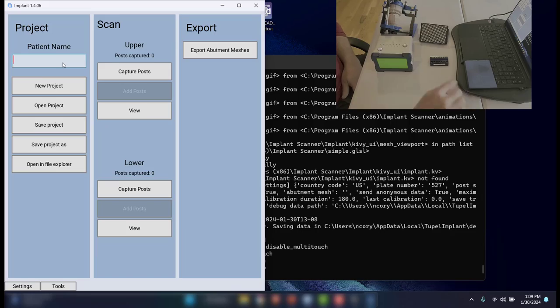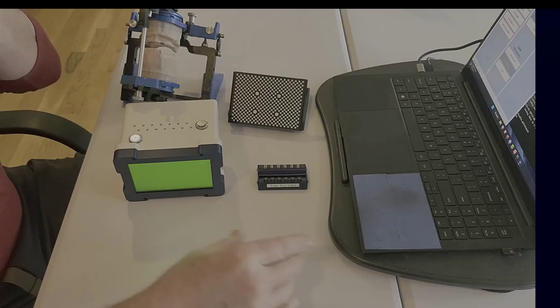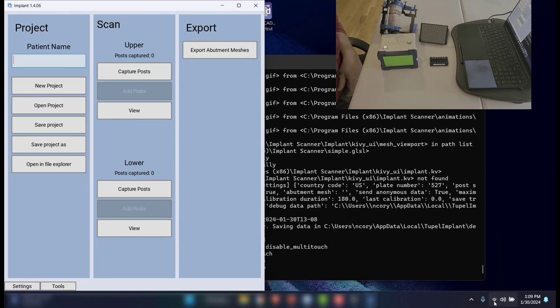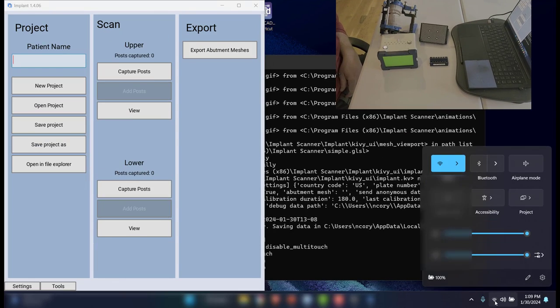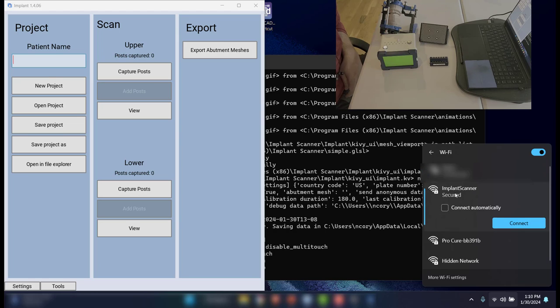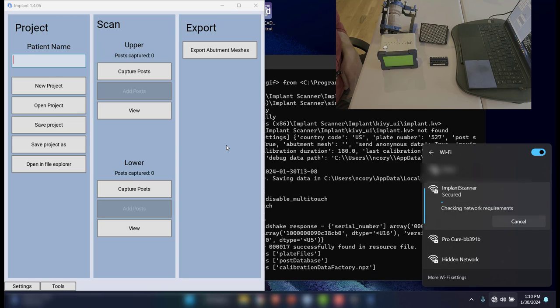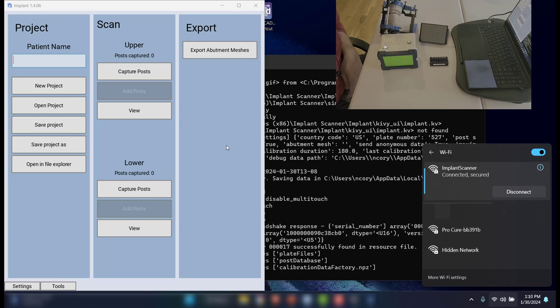All right. Notice that the scanner screen has turned green in the viewfinder now. That's indicating that it's ready. And so once it is ready, I do need to connect to my wireless connection. And you can see it shows up right here as implant scanner. The Wi-Fi password is going to be in the instructions for the scanner, so let's connect to that. All right, so we're all connected now.